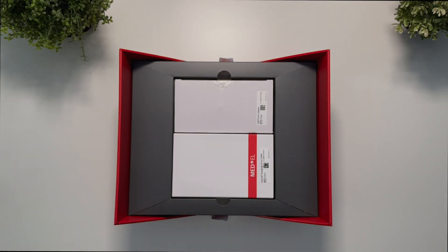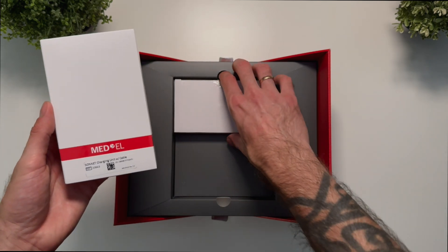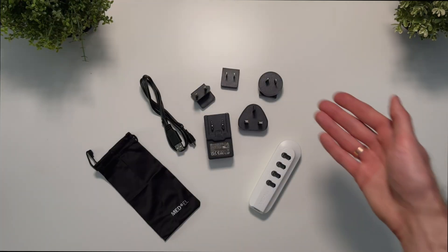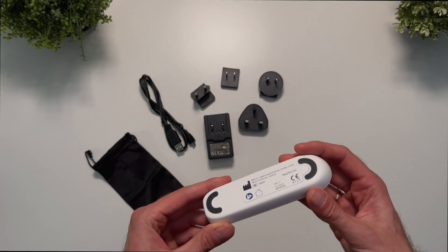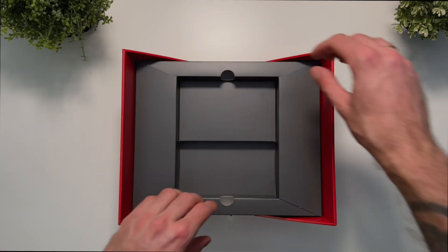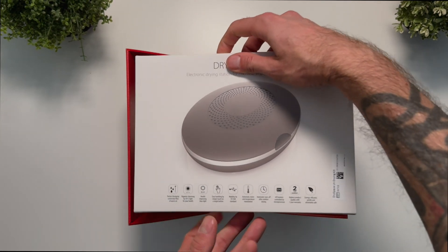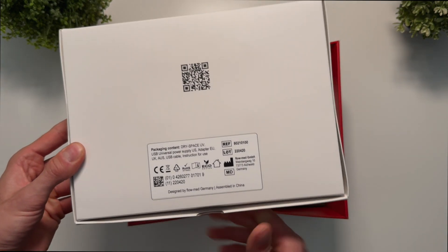Next we have the battery charger and power supply — these are the same as those included with the Sonnet 2. Below that we have the UV dryer, also the same as the one included with the Sonnet 2.